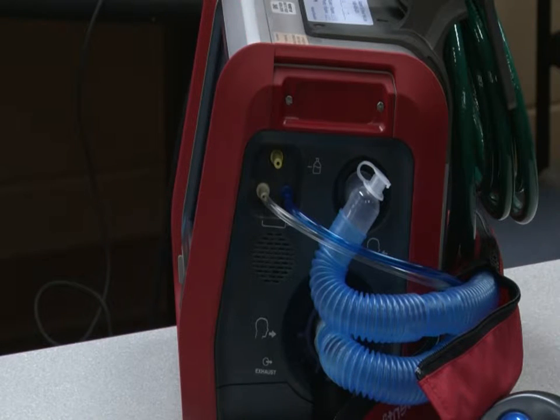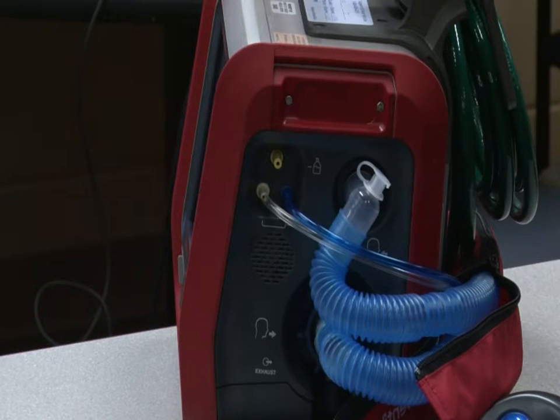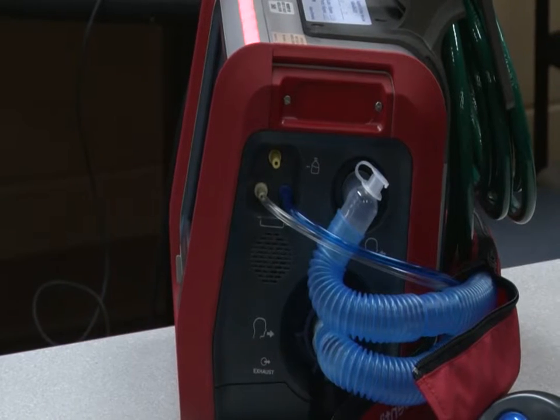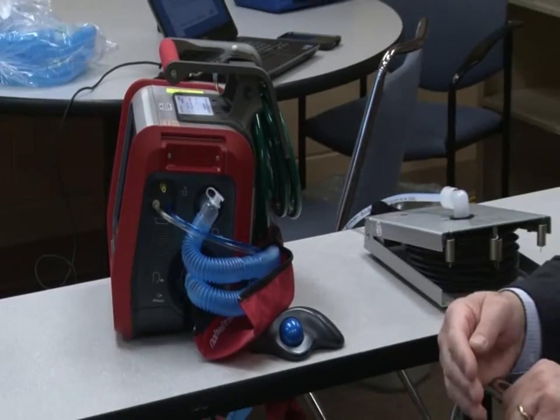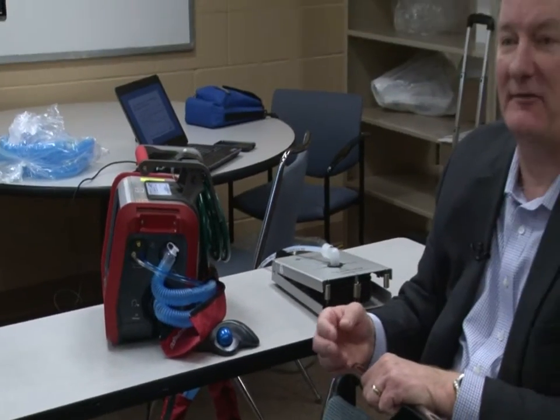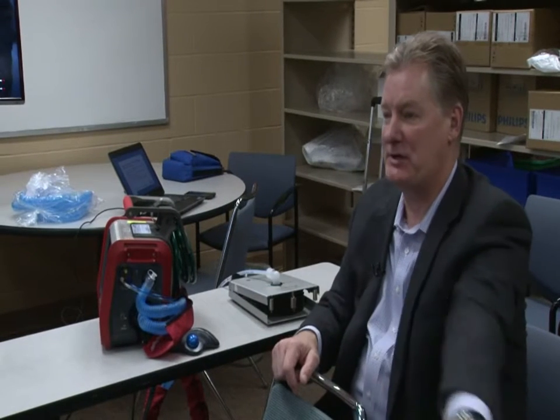In a pinch, you could put it in front of the flow sensor, but if you put it in front of the flow sensor, you absolutely must power it off the ventilator and must not power it off of something in the rig or the aircraft, especially if you're in ASV, because remember that flow sensor is measuring volume going in both directions. If you're running it on a continuous flow, during exhalation and after the patient's done exhaling, there's not enough pressure from that nebulizer to push it into the patient.